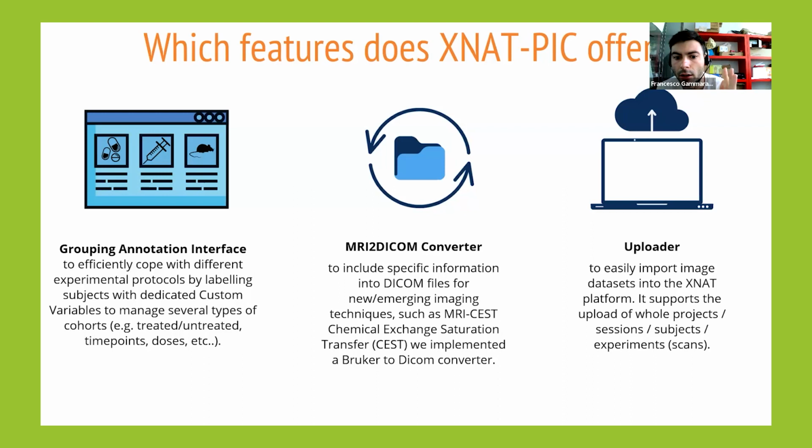And then XNAT-PIC offers a converter to convert Bruker file format to DICOM standard, and we have added the possibility to save some private DICOM tags for new imaging technique, such as the CEST imaging. And then XNAT-PIC allows you to import image dataset into the XNAT platform in a very easy way. And the uploader supports the entire project, sessions, subject, experiment.